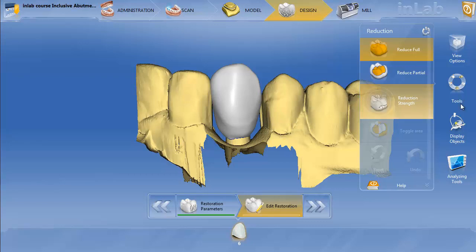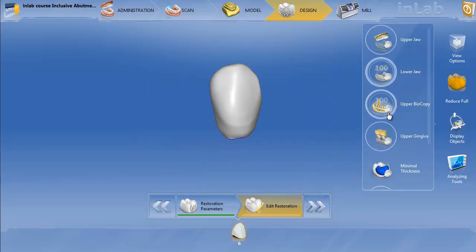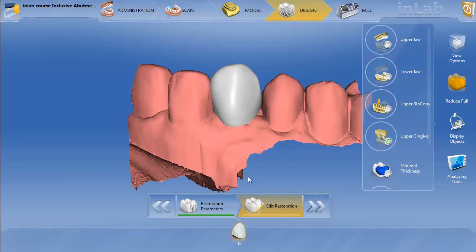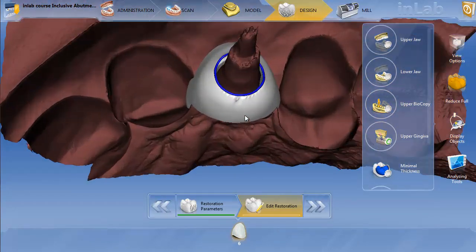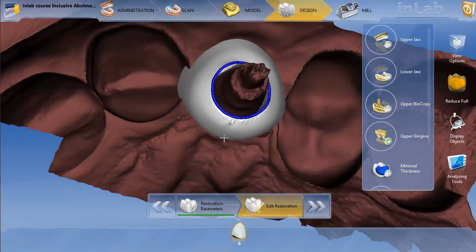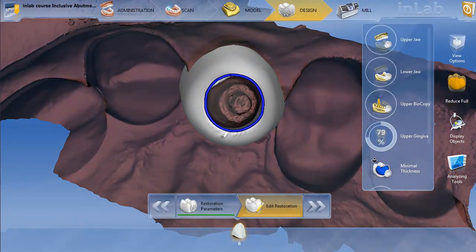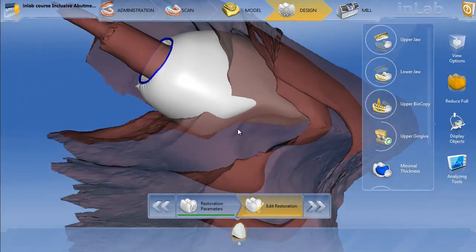So the way we're going to do this is I'm going to take my display options. Let's turn the upper jaw off, turn the upper gingiva on, flip the crown upside down, and then we get an idea of where the gingiva is at. We can actually turn it a little transparent if we'd like as well.